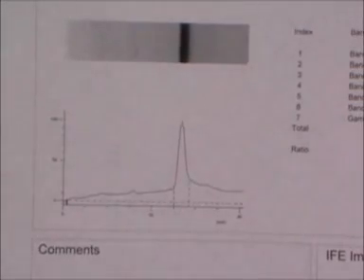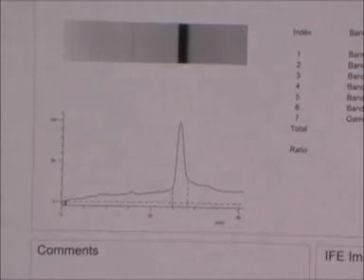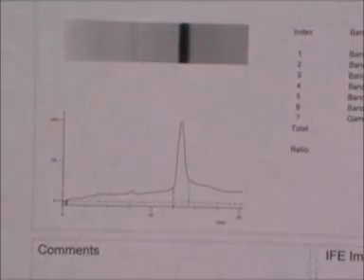Next you can see the scans of each of the sample tracks, with the protein concentration being displayed graphically. In each scan the anode is to the right and the cathode to the left.